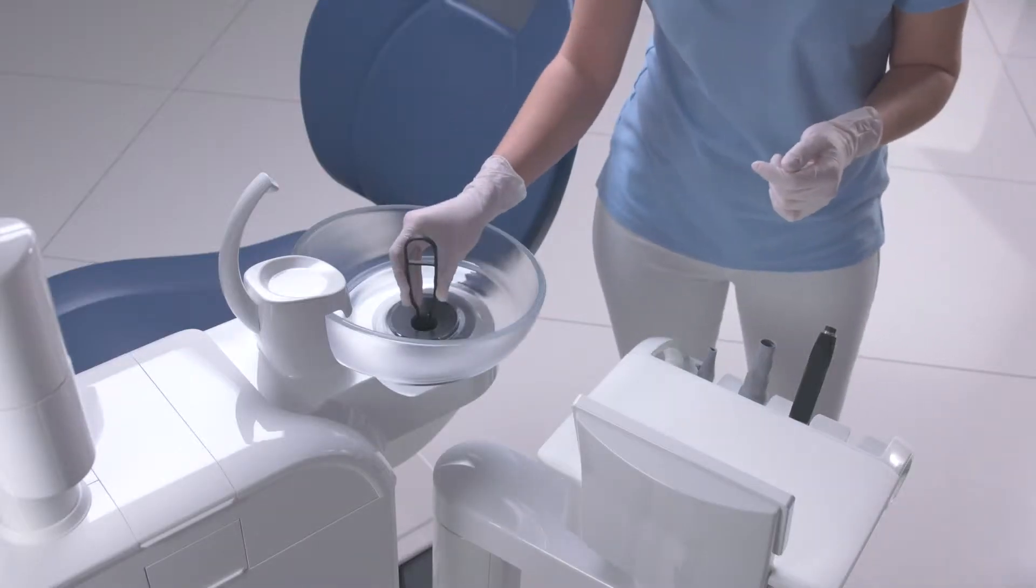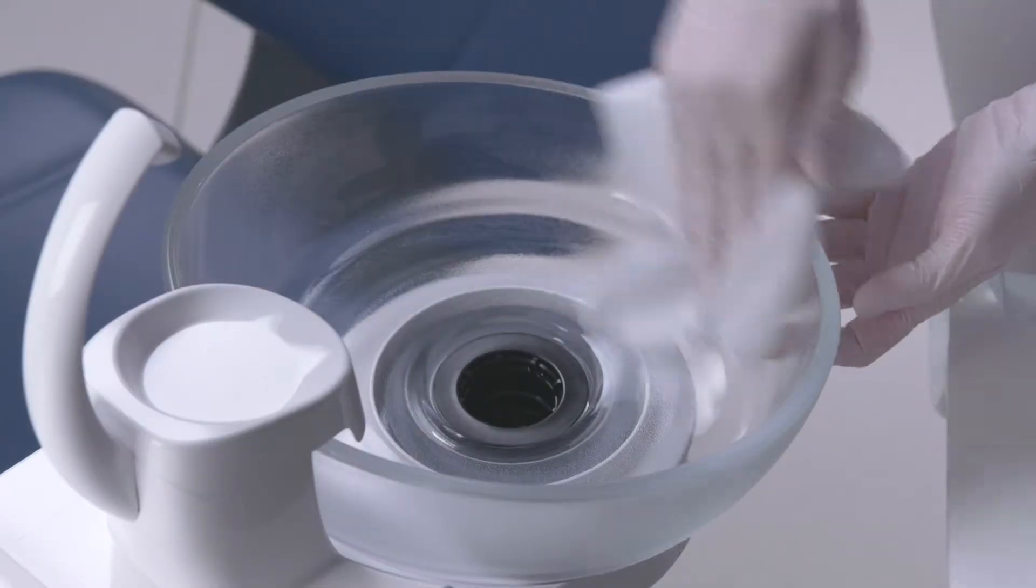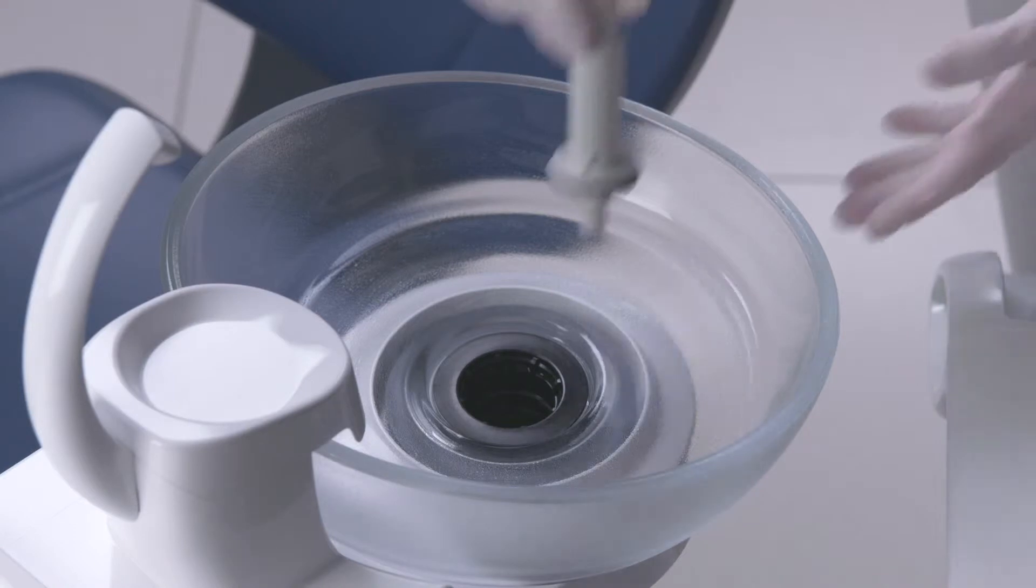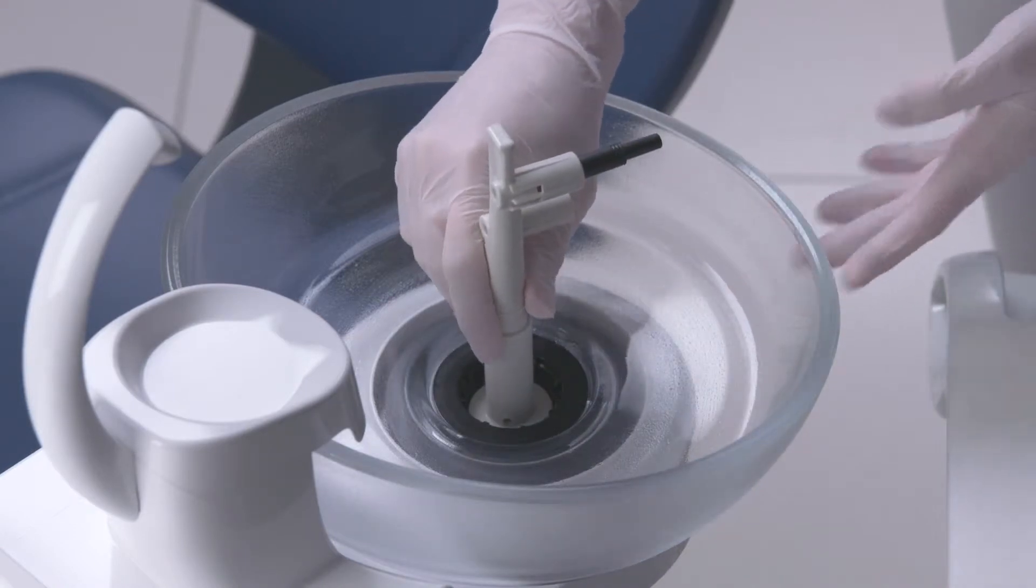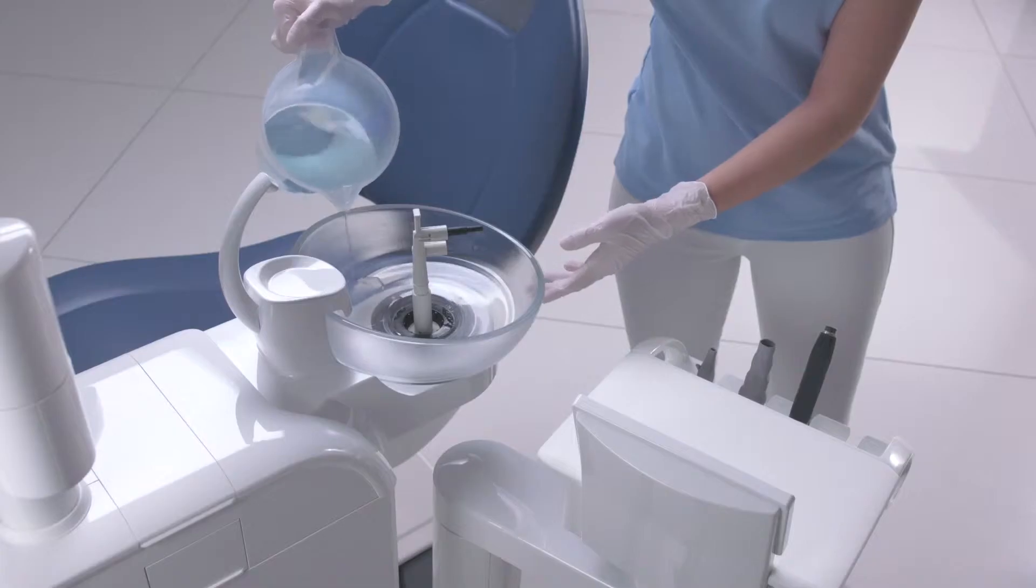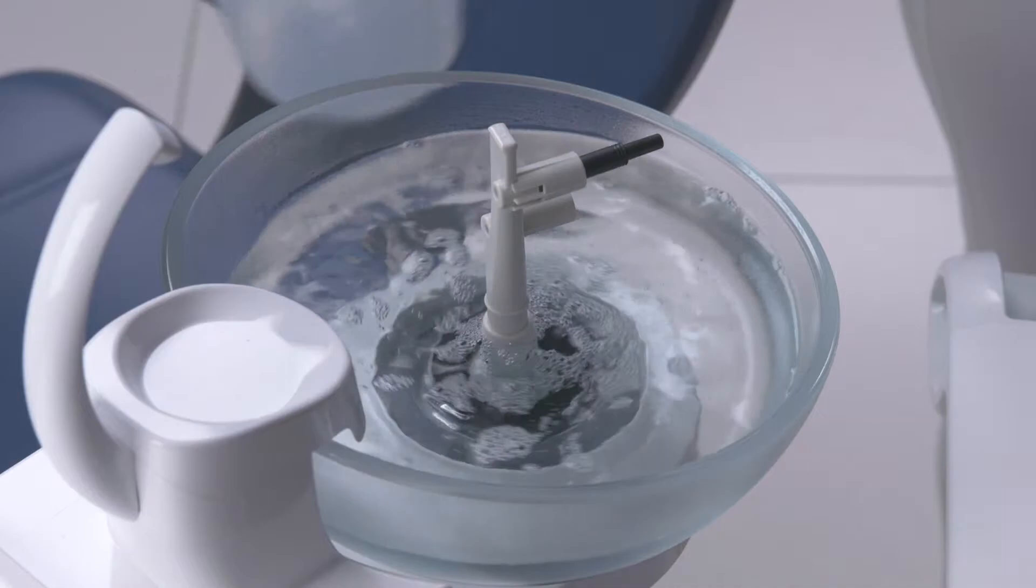Remove the gold trap, then clean the cuspidor. Insert the cleaning adapter, making sure it is inserted as far as it will go. Prepare the cleaning solution as per the manufacturer's instructions and pour this in the cuspidor.